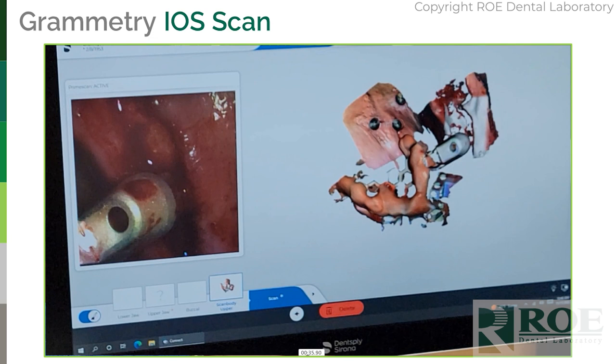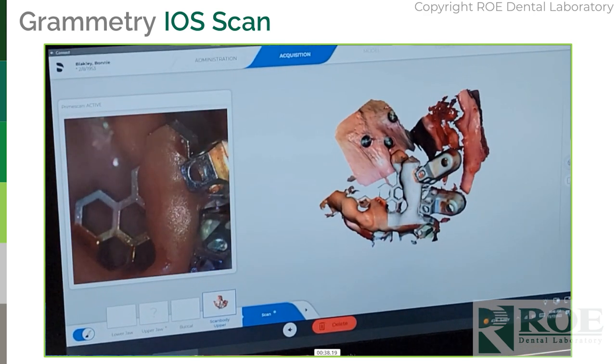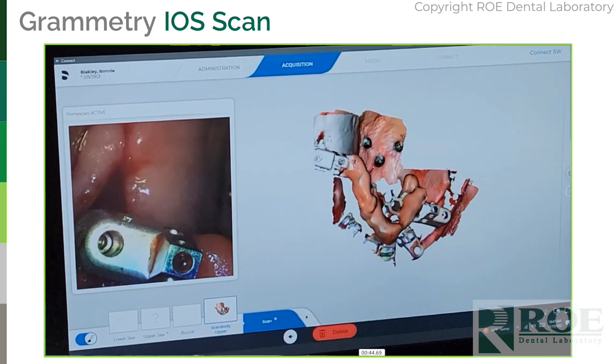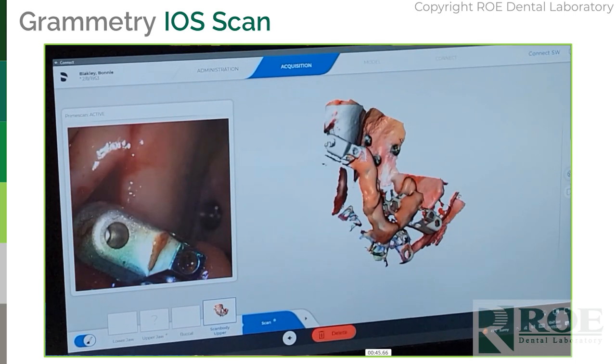Let me show you here. Then you come out to a scan body, and then you go back to the original area. Now, in this case, you'll see they're going to come back, and then they're going to go out to another one, like this, and then they'll go back to the center, right? Go back to the center and just keep picking them all up.